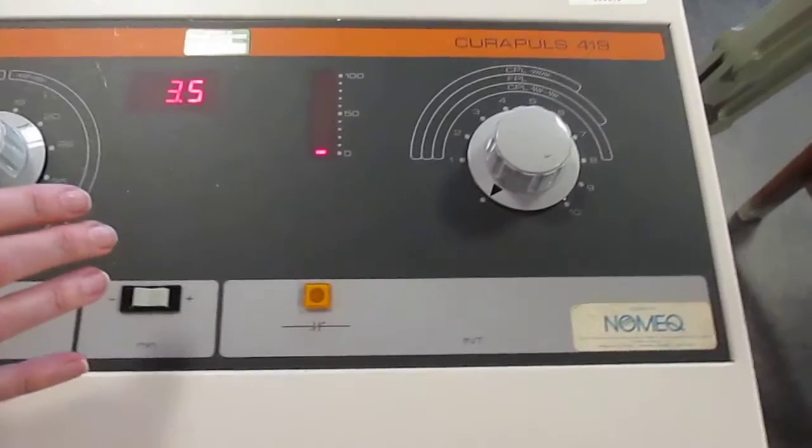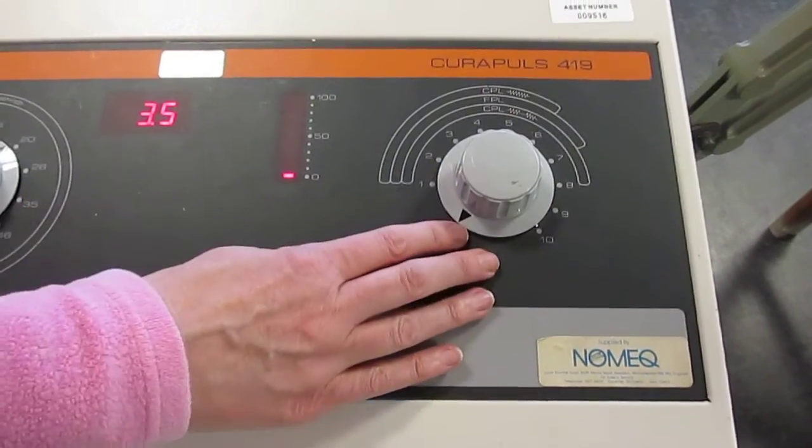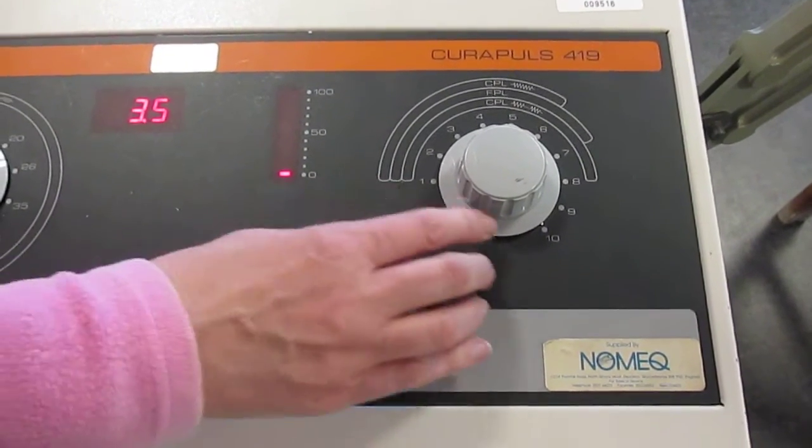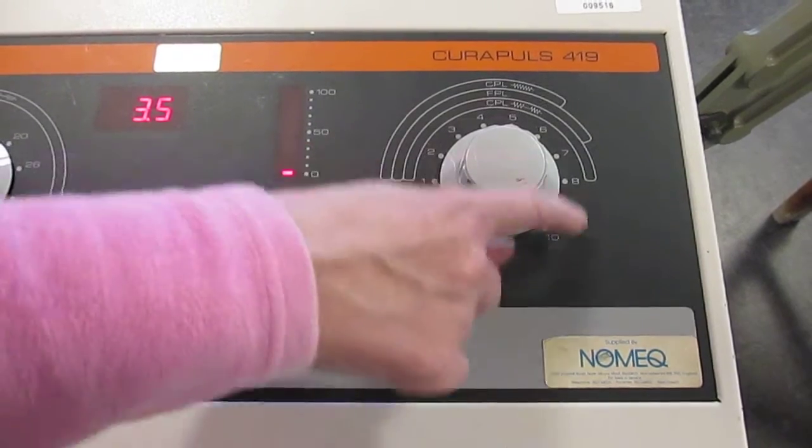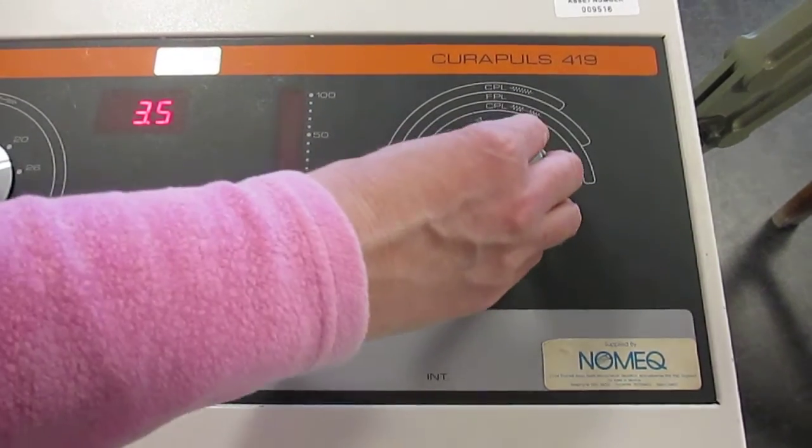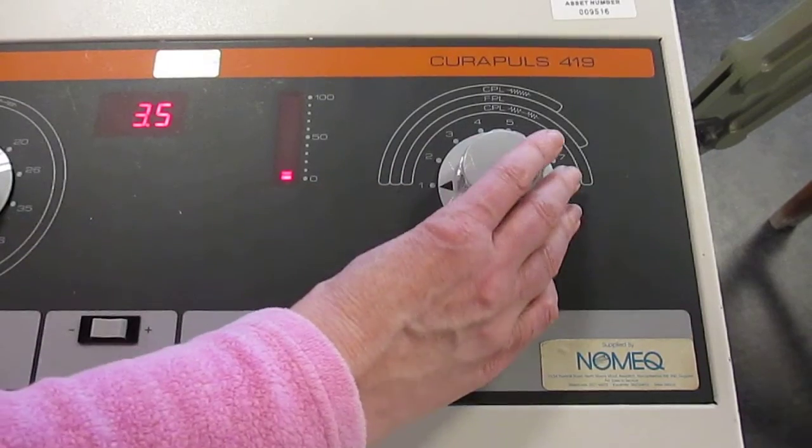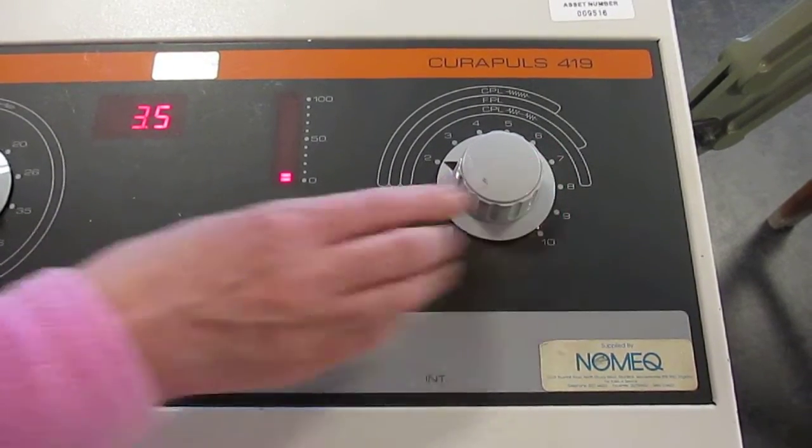Finally, you're going to increase the peak pulse power, which is numbered from 1 to 10. 1 being 10%, 10 being 100%. You can steadily increase the dial and you will see the gauge here increasing.